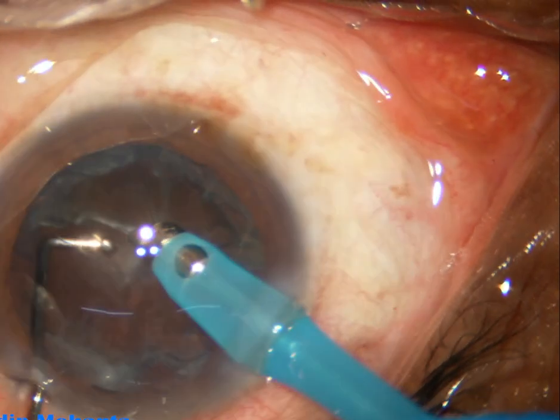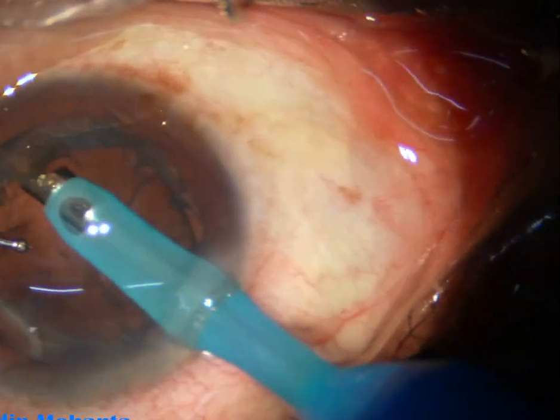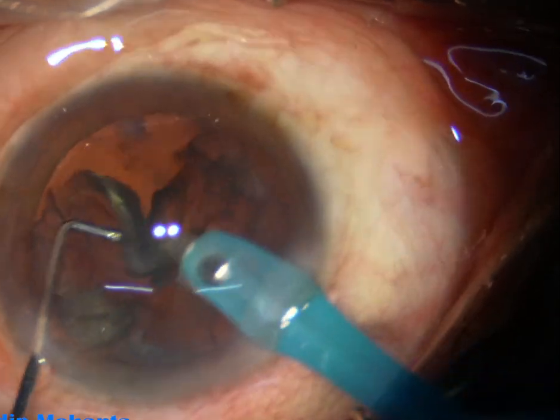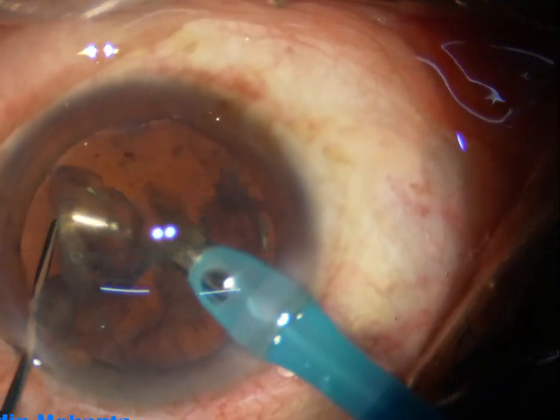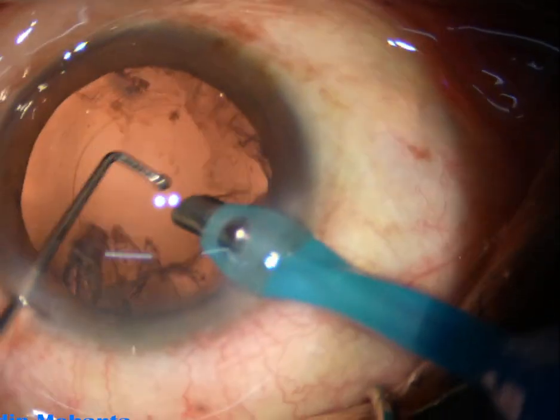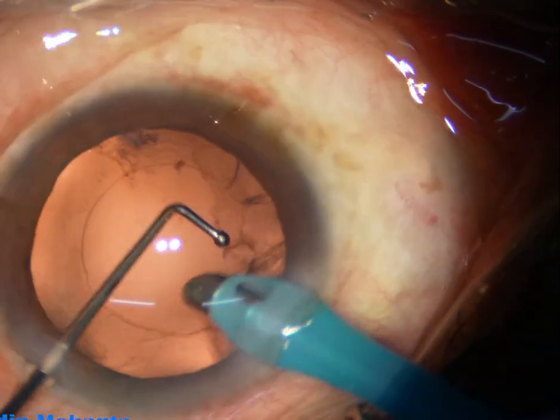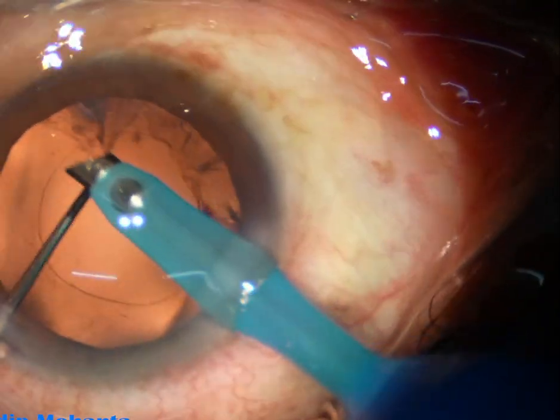Now this piece — how to get this — it's very difficult. Just hold the edge of the epinucleus and use the ball-tipped chopper to remove it. Most of the cortex has been removed by the phaco handpiece itself.